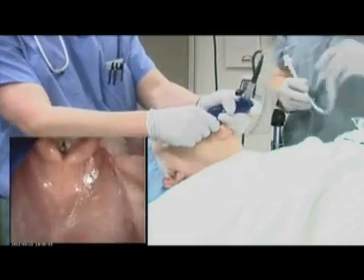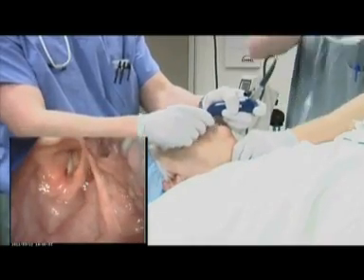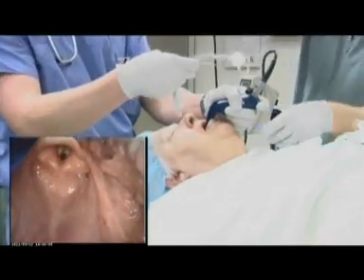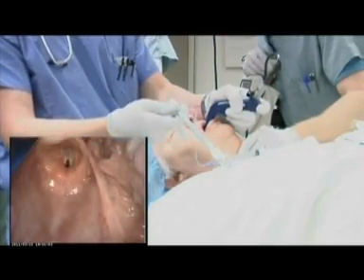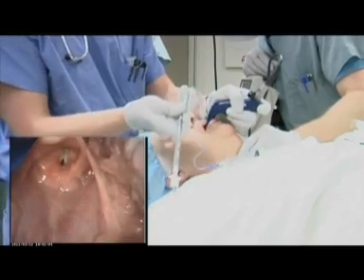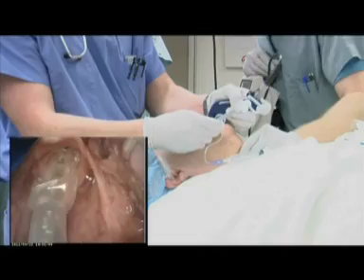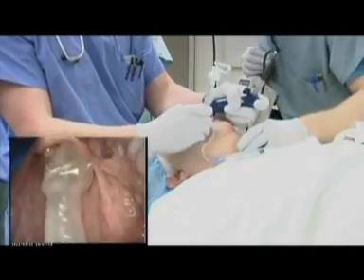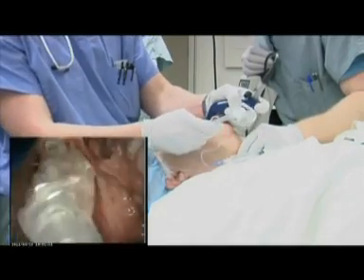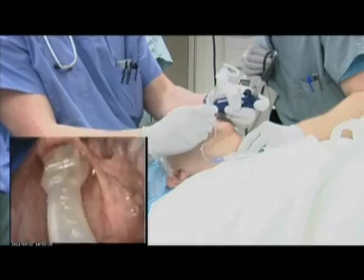While still achieving a Cormac-Lehane Grade 1 view, note the differences in distribution and proliferation of laryngeal soft tissue. In this case, additional endotracheal tube manipulation, along with external posterior superior laryngeal displacement, is necessary to successfully pass the endotracheal tube.